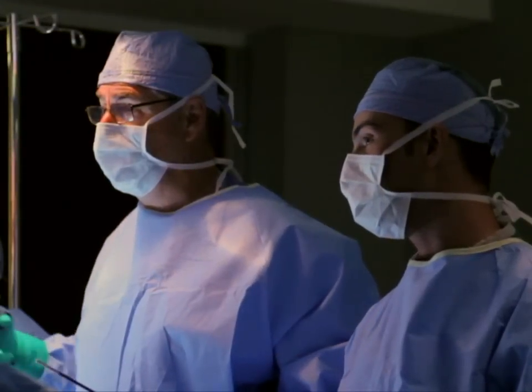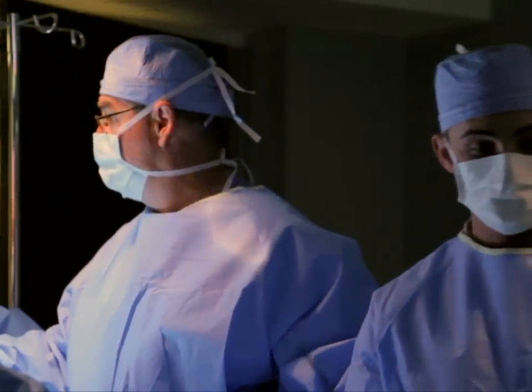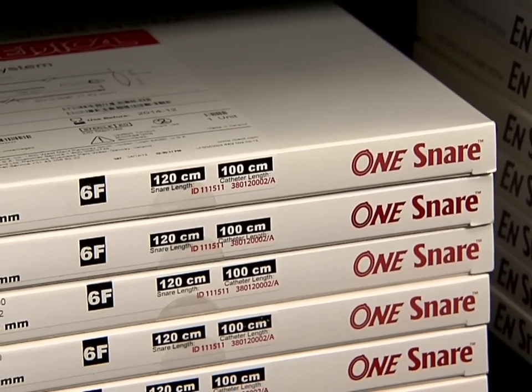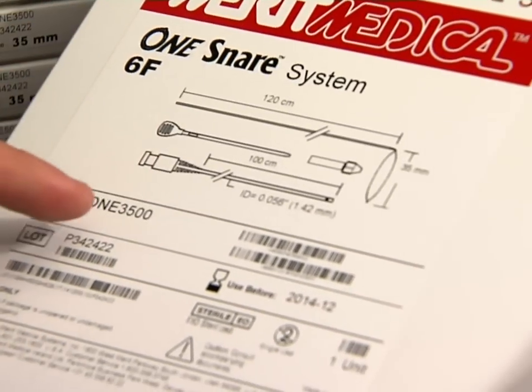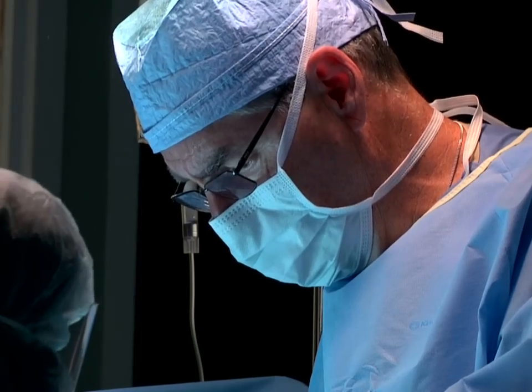There are certain procedures that require a physician to reach for an endovascular snare. Some are planned while others are not. Regardless of the circumstance, physicians rely on an endovascular snare that provides accurate foreign body retrieval to reduce procedure time and increase reliability to minimize complications.